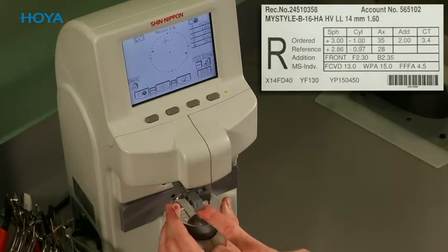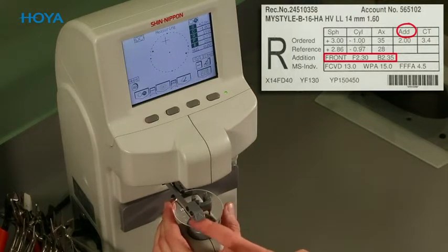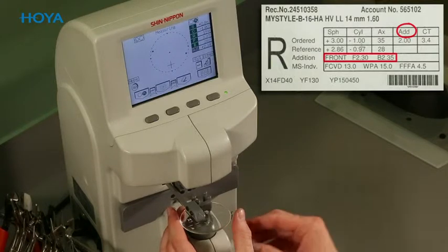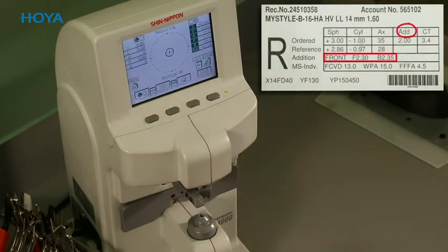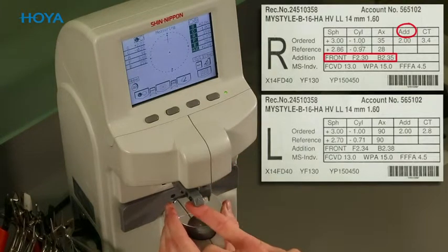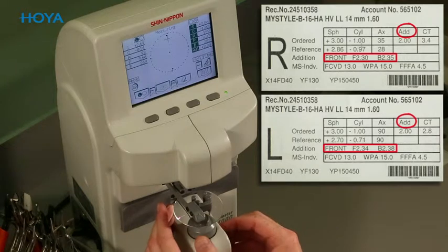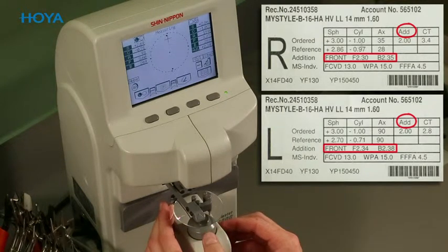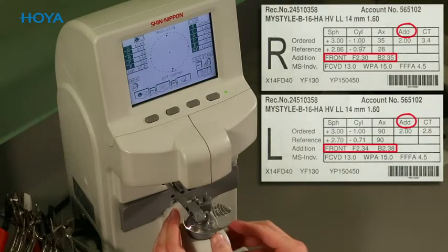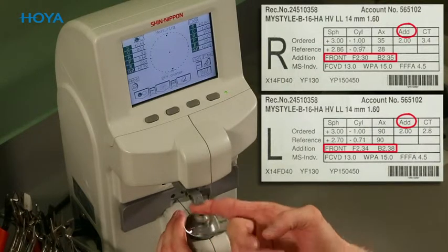In order to verify the addition power, please decide if you want to check either the back surface or the front surface addition power. For your convenience, both are printed on the lens envelope. The addition value is measured as the difference between the mean power in the near reference point and the mean power in the far reference point. The mean power is the calculated value of measured spherical power plus half of the measured cylinder. Keep in mind that both mean power values need to be measured on the same surface depending on your decision.